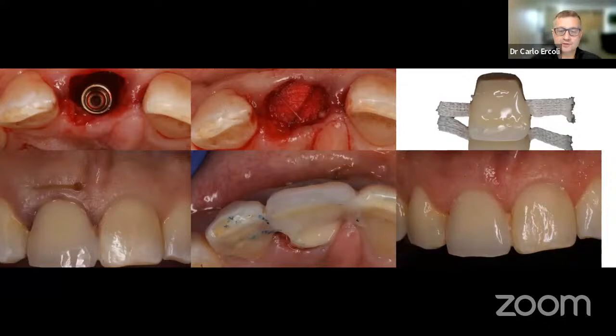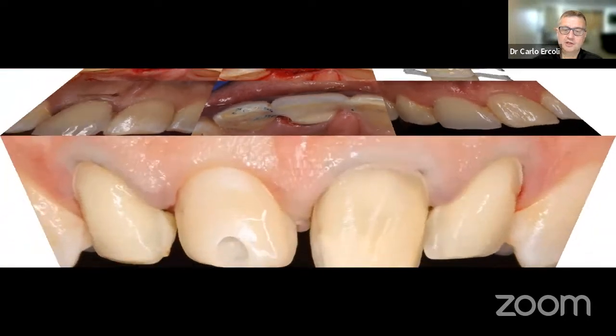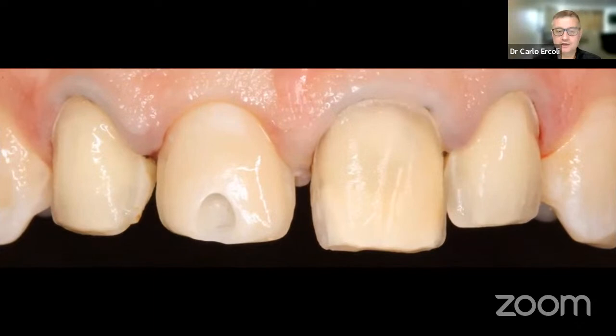If your implant does not have enough primary stability, and you don't feel comfortable placing an immediate temporary crown, you either place an immediate healing abutment that is customized to the shape of the soft tissue, or you may place a pontic, like you can see here. This is just a fiber-reinforced bridge with a pontic that goes right in the socket, and basically supports that ideal emergence profile so that the soft tissue will heal around that pontic. We just need to go back then and finish your restoration.